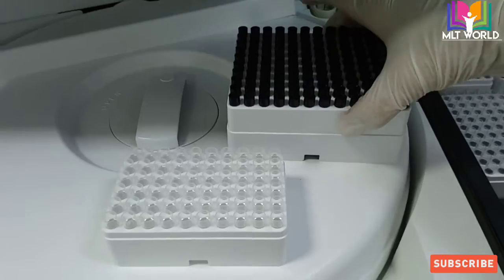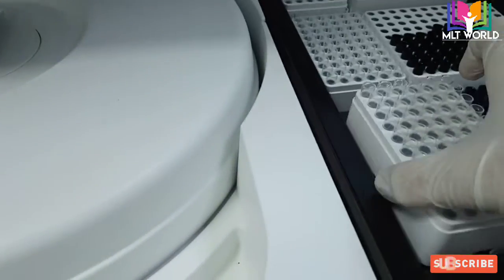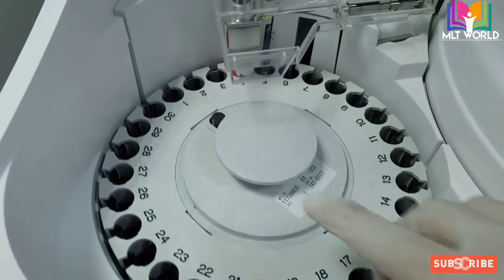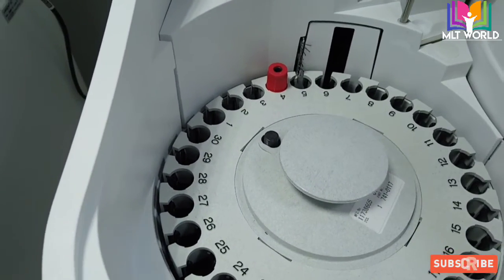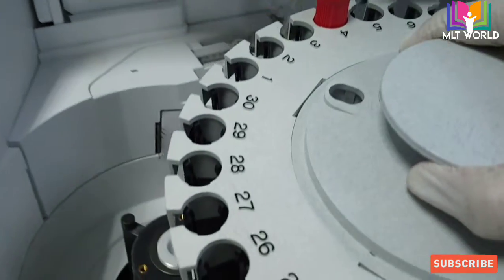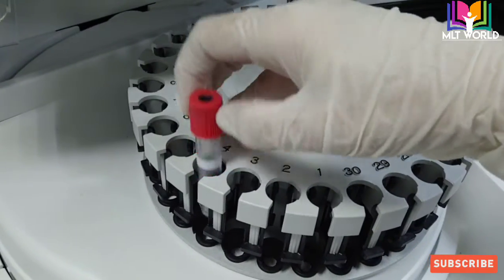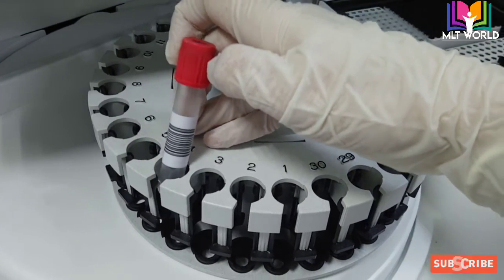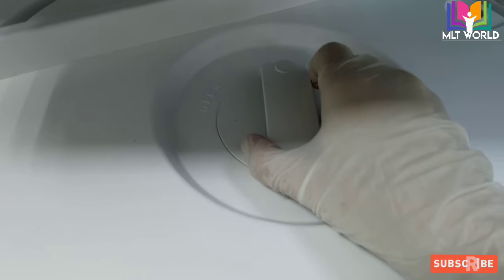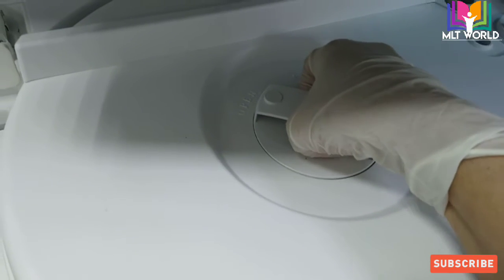We will keep one assay cup tray and one assay tip tray in the empty space. After that we will keep the reagents. Now our consumables and other related reagents are ready. Here we will keep the samples — we open the cover, take out the rack, and run the samples. But before running samples, we keep the reagents. This tube is used as a stop tube: when the machine reads its barcode, it will detect this is the last sample.